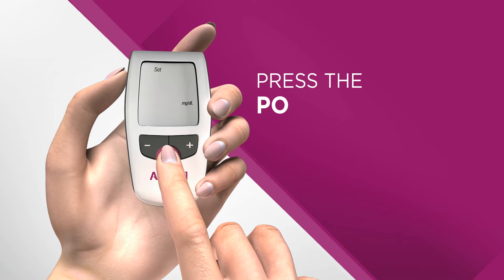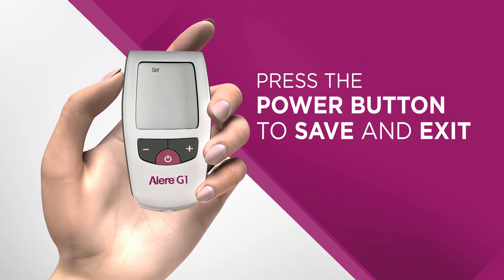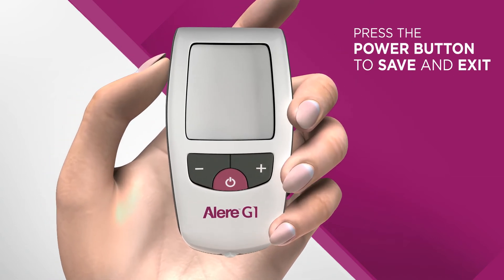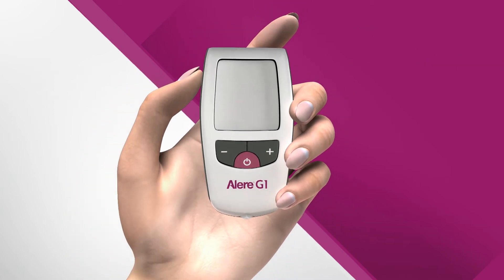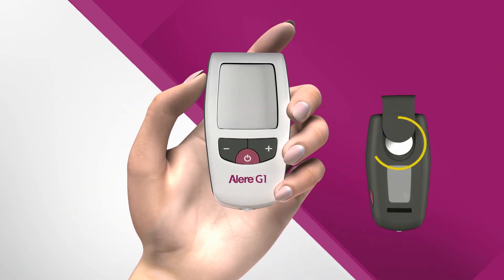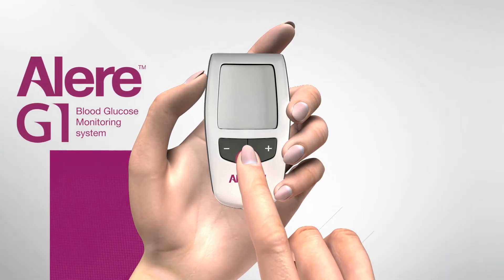To save, just press the power button again and release. The monitor will turn off. The setting information you've entered is now saved. You do not need to repeat this again until you change the battery.